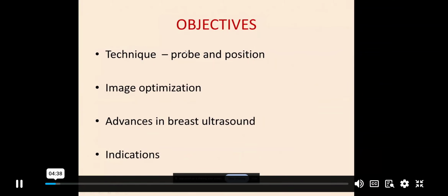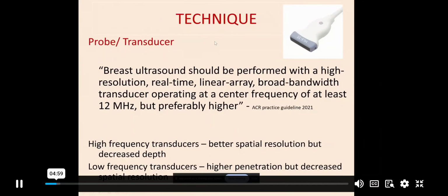My main objective in today's session is to discuss the technique of breast ultrasound, including what probes should be used, what positions should be used, and how we optimize the image settings. I will also cover a few advances in breast ultrasound, and in the end, the indications of breast ultrasound.